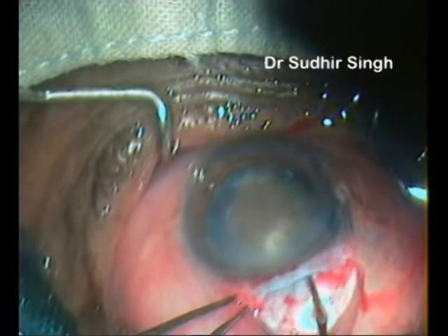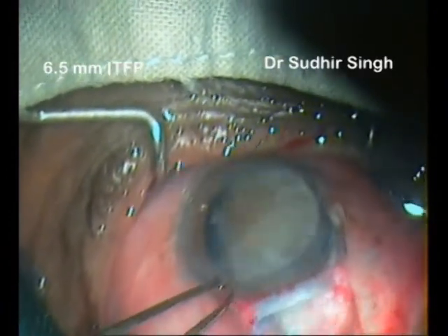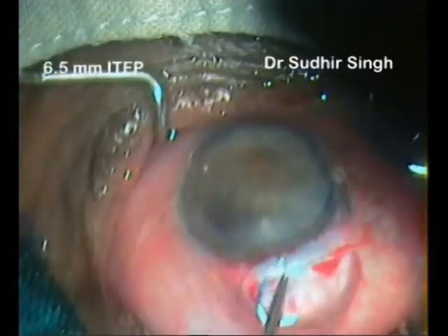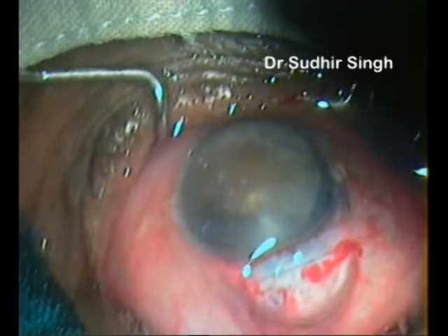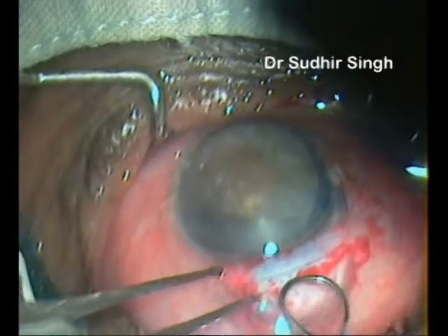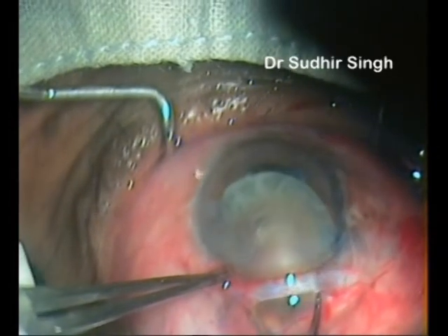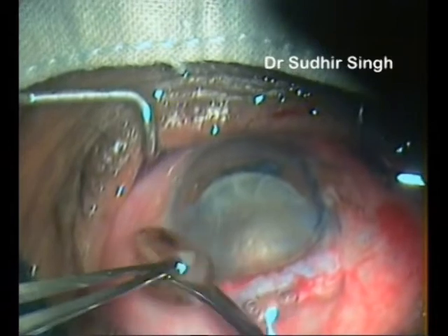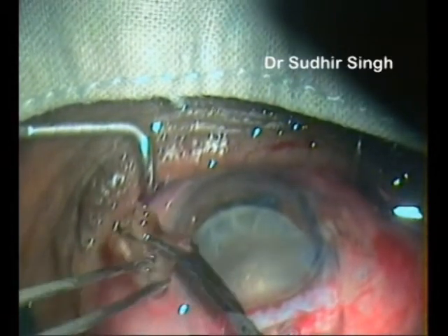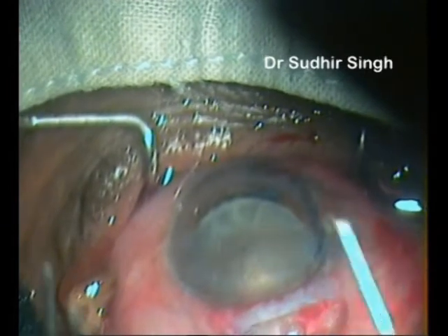The nucleus is prolapsed into the anterior chamber with the Sensky's hook. Vectis is introduced and positioned behind the nucleus. The nucleus is engaged in the vectis and slowly withdrawn while the posterior lip of the tunnel is depressed. When the nucleus gets engaged in the tunnel, the vectis is pulled posteriorly and upwards. This causes breaking and removal of a part of the nucleus, and the other part remains engaged in the tunnel.